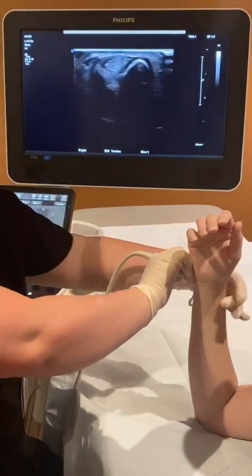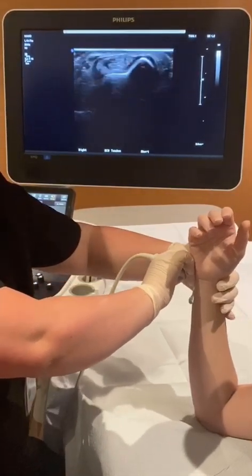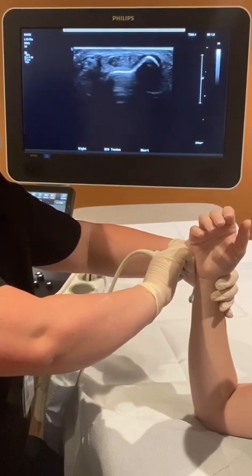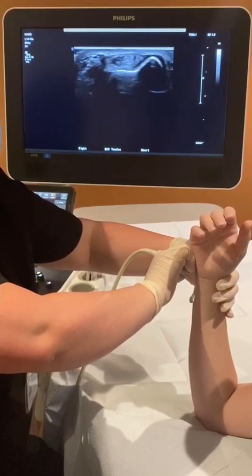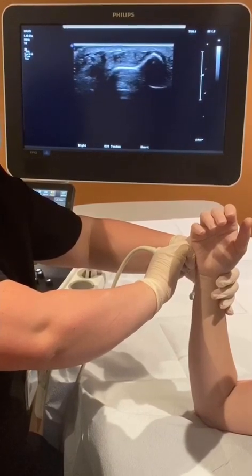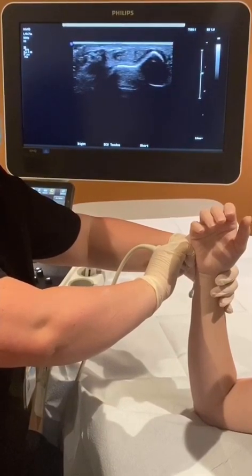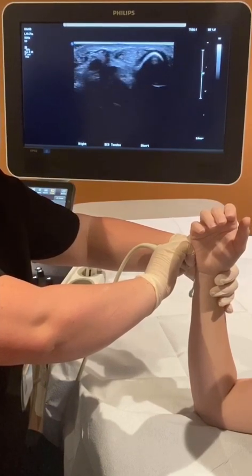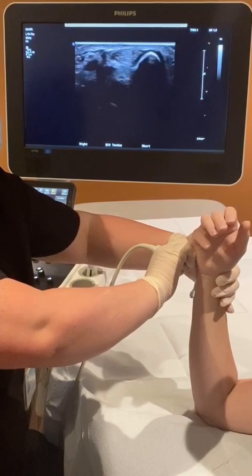What you want to do is stabilize your hand on the wrist so that when you do the dynamic evaluation you don't slide off. Then you're going to have the patient gently supinate their wrist while you move the transducer and your hand with her wrist during supination. Go ahead and supinate your wrist.